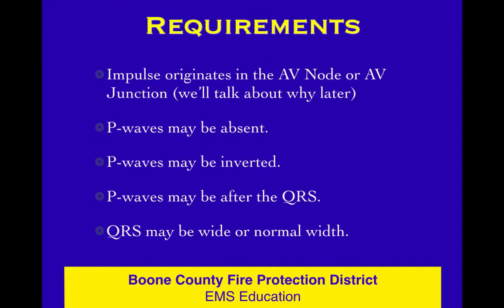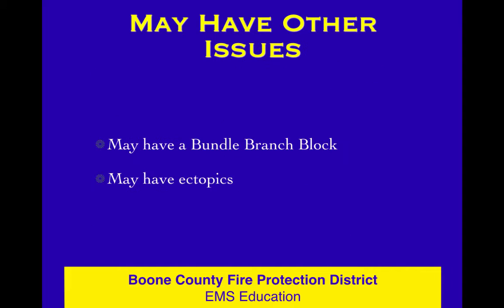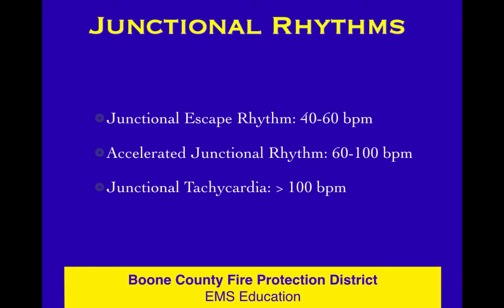So junctional rhythms, although not very common, you really can't key off the P-wave and you really can't key off the QRS. They may also have other issues — you can have a junctional rhythm that's aberrantly, abnormally conducted with a bundle branch block. You may also have a PVC in your junctional rhythm.